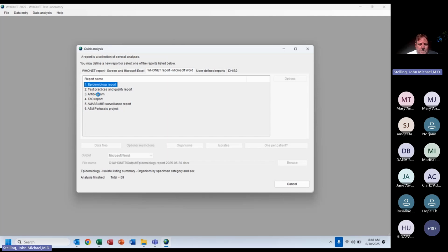The antibiogram report I will show, that's new, and that's all of these different stratifications. FAO report, we started that a few years ago, but we never finished because they said, John, thanks, but we need Infarm. So we stopped working on this FAO Word report because Infarm was needed. So we jumped over to Infarm. Now we're going from FAO Infarm first year. We're now incorporating second year.